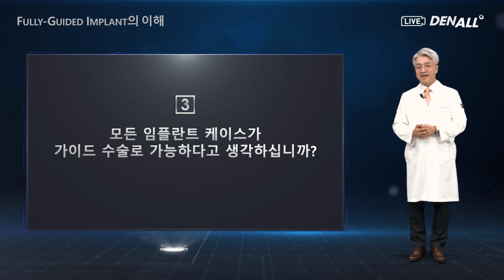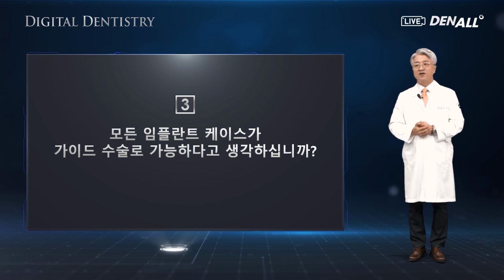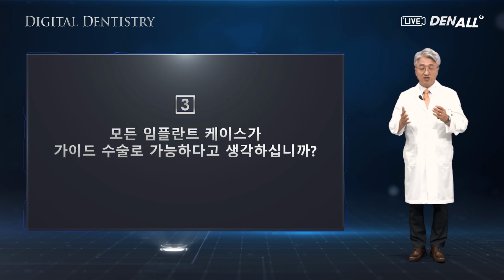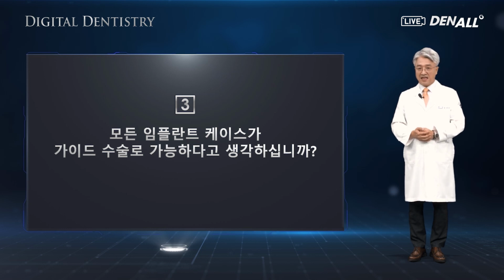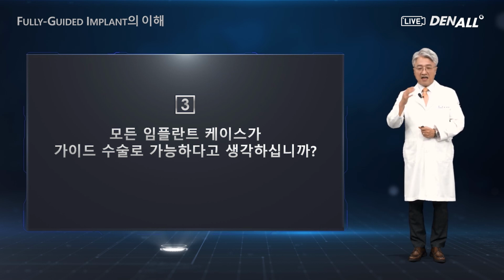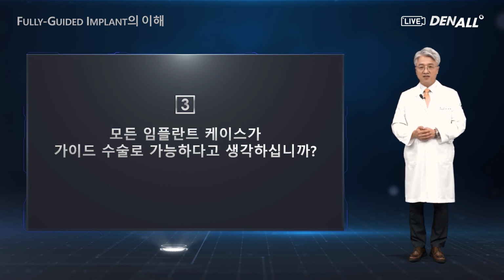So the guided surgery simulation is used for all those, and the guide systems and the drill systems are available to do all the planning and actual surgery as planned. Therefore, I believe the guided surgery can be used in simple or very complicated cases to make the cases more complete. Guided surgery system can be used for all such cases. I can say that with my confidence.